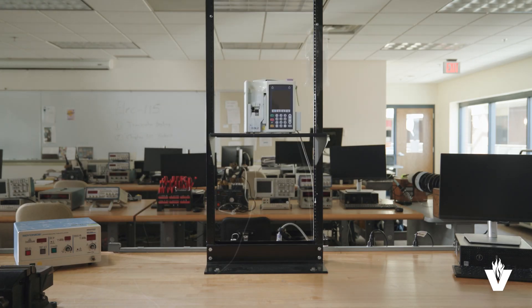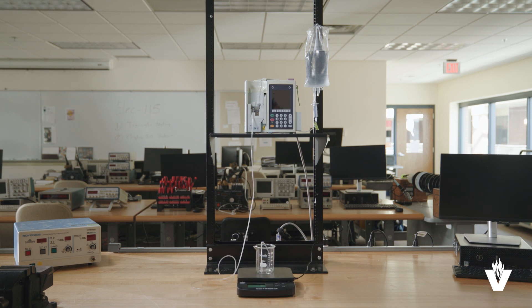At this point, the pump is ready to undergo full flow testing. That's how we set up the IV pump station. To learn more, look for our other videos on biomedical equipment processes and procedures.